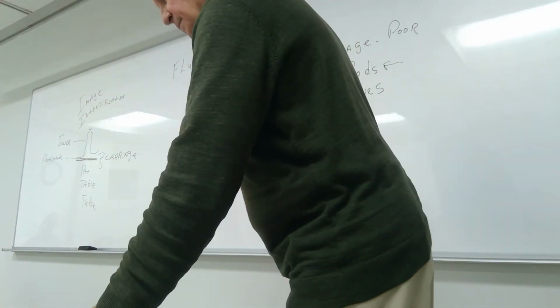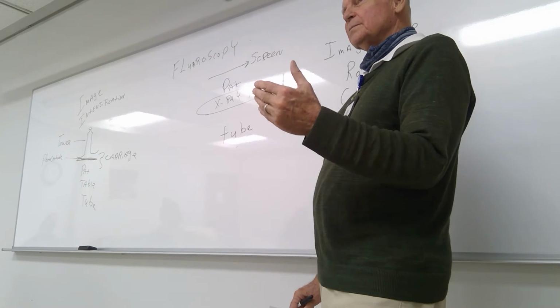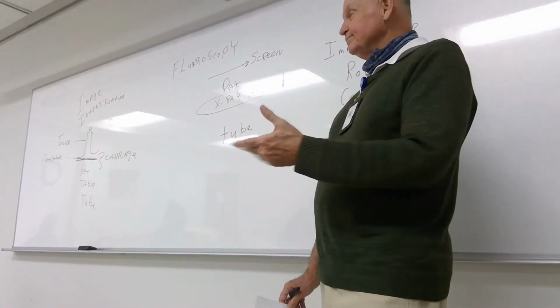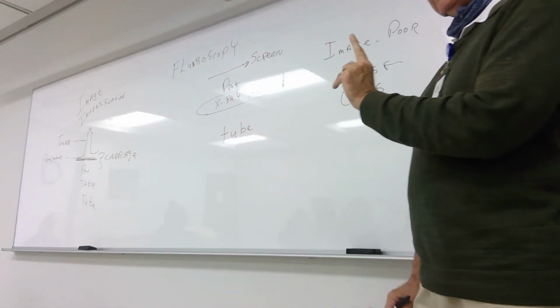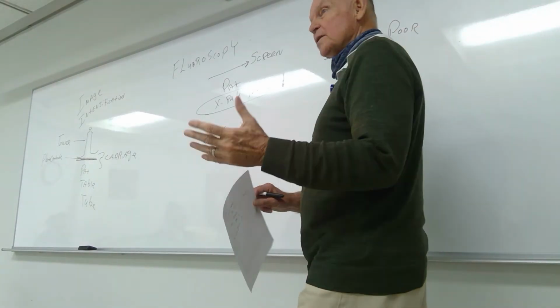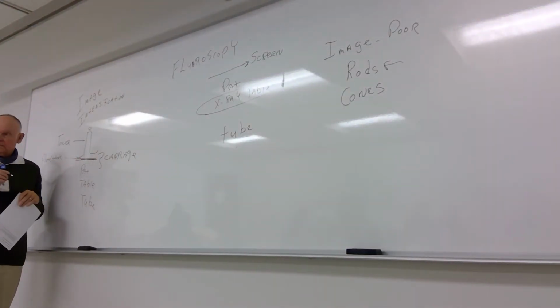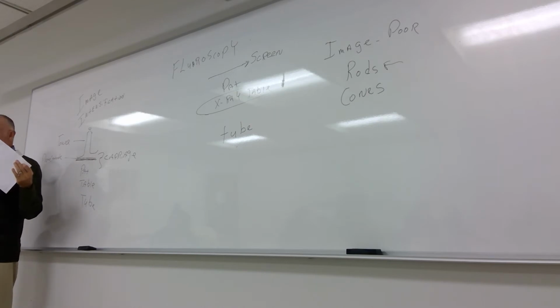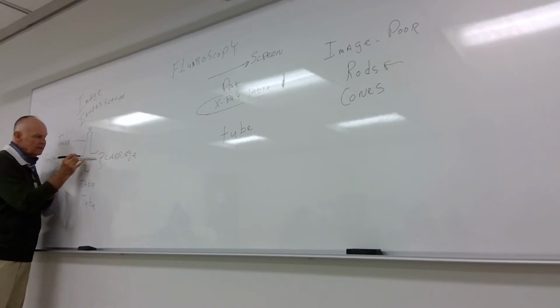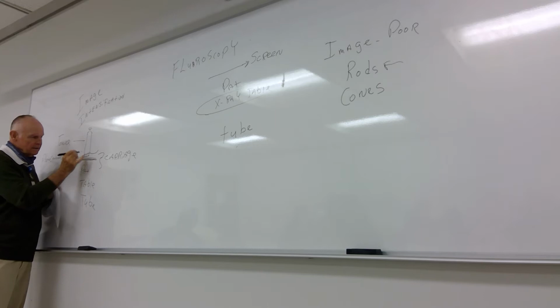Electrode. Does the cathode create electrons? That's what this does. It takes light and turns the light into electrons. So now we have an electron beam. We're just changing these forms of energy. We started with X-ray, we went to light, and now we have all these electrons.